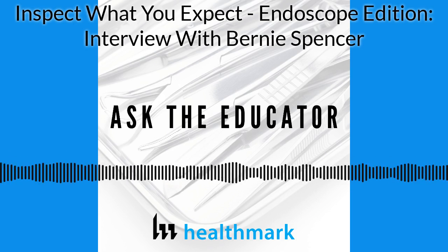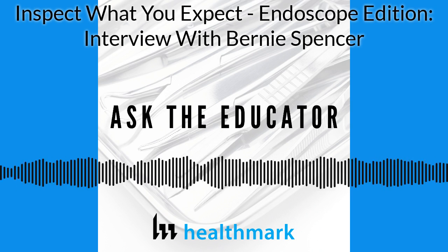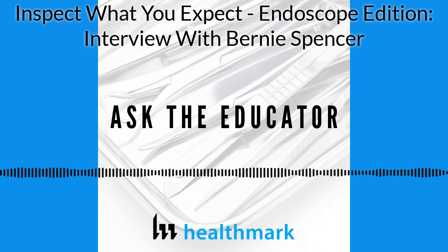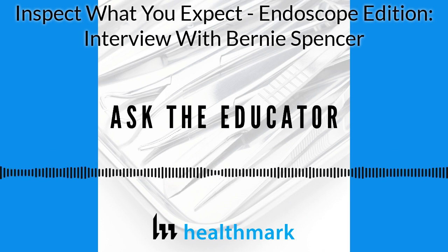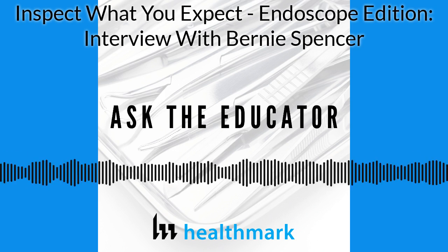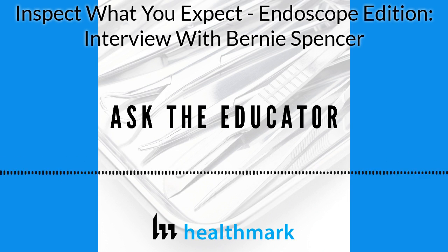I think what you uncovered is some pretty significant evidence that internal damage to our endoscopes does in fact impact the cleaning efficacy. And if you're not testing or if you're not visually inspecting, then there are chances that you're missing some contaminated endoscopes in your process, which unfortunately would lead to an increased level of risk. So I think you uncovered some valuable information there. You found a scope that was getting more failures in your cleaning verification test than any other scope, which turned out to be a damaged endoscope. I mean, that's a pretty significant finding.